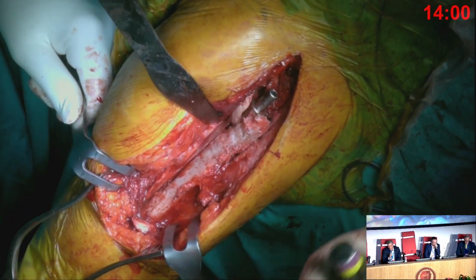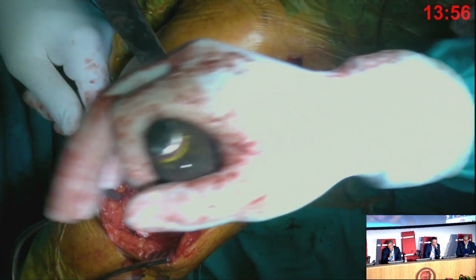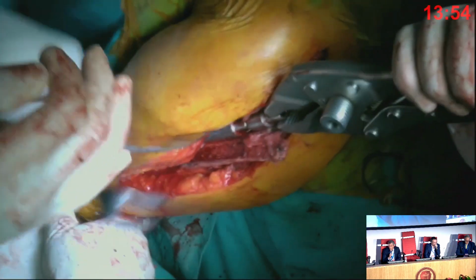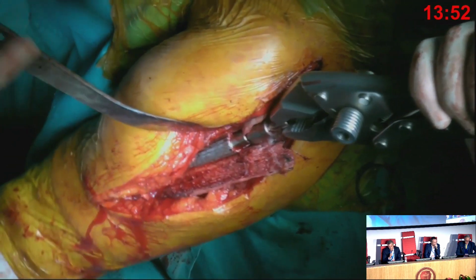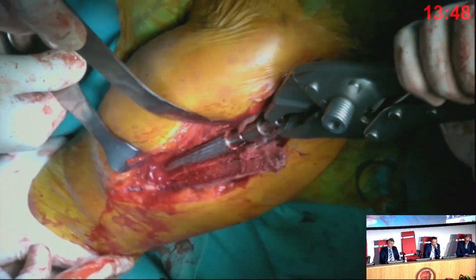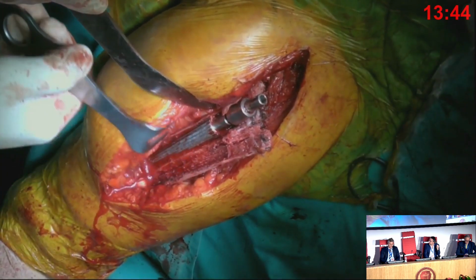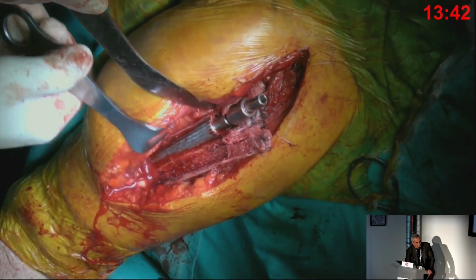And then we just very carefully try and open the linear osteotomy, and if the stem comes out, great, and if it doesn't, then we extend it to the L, which means a bigger osteotomy. And then, Dr. Antuna, which is the final osteotomy? Is it inferior to the cement line, or do you do it at the level of the prosthesis? What is your rationale to extend the osteotomy distally?